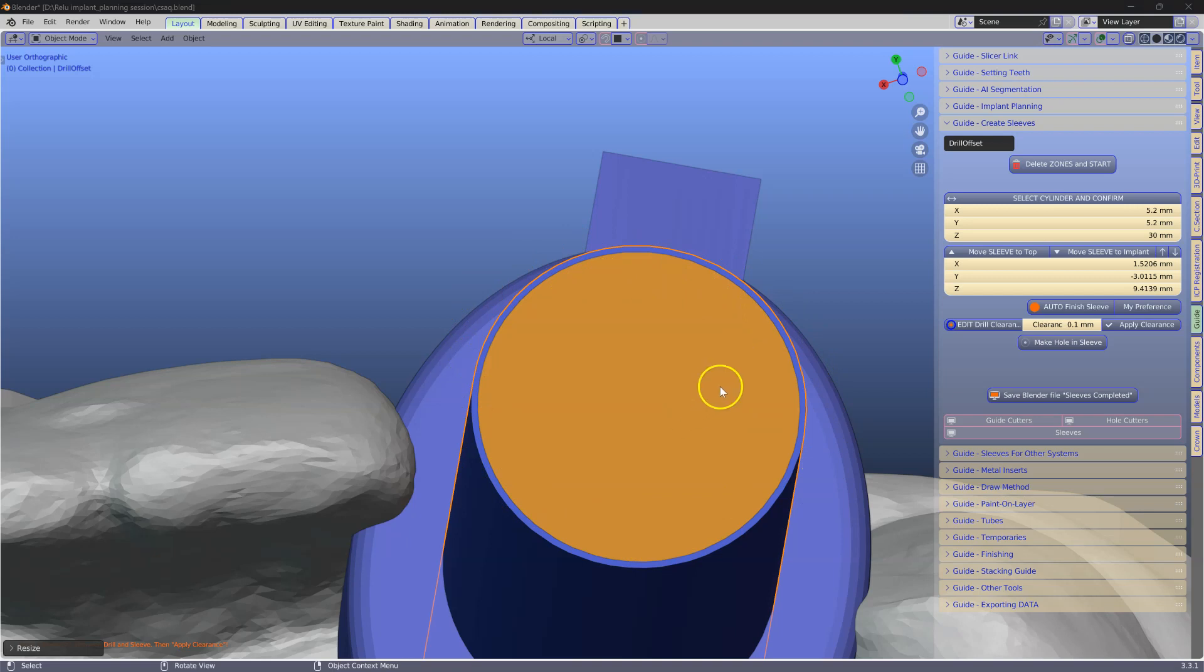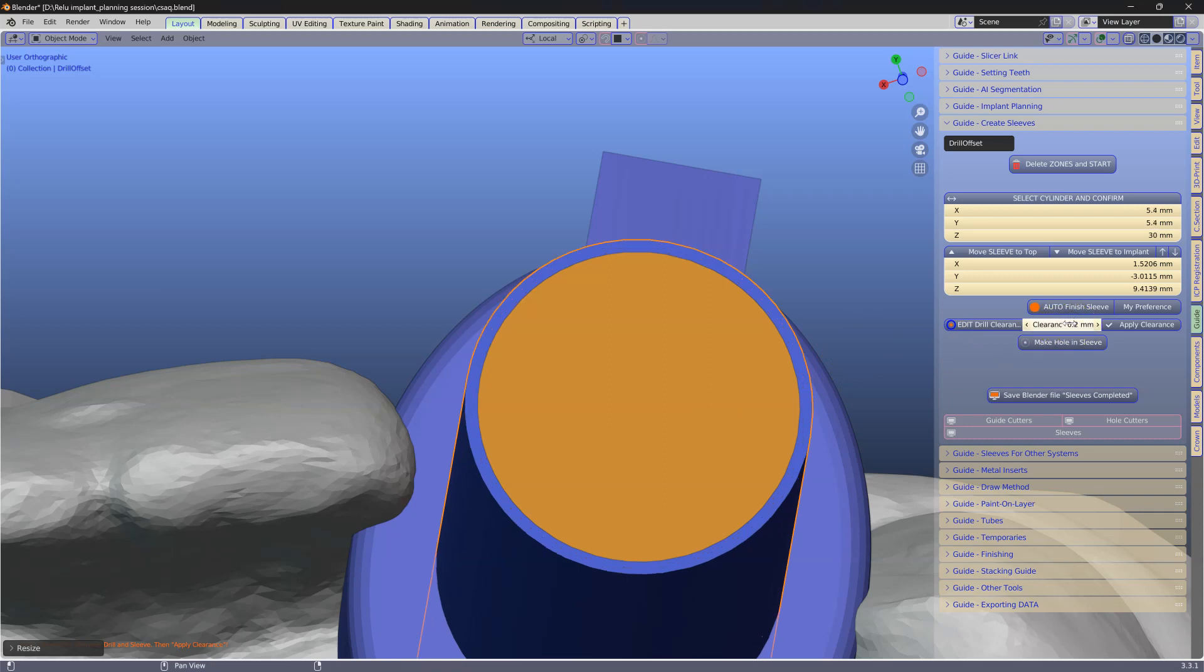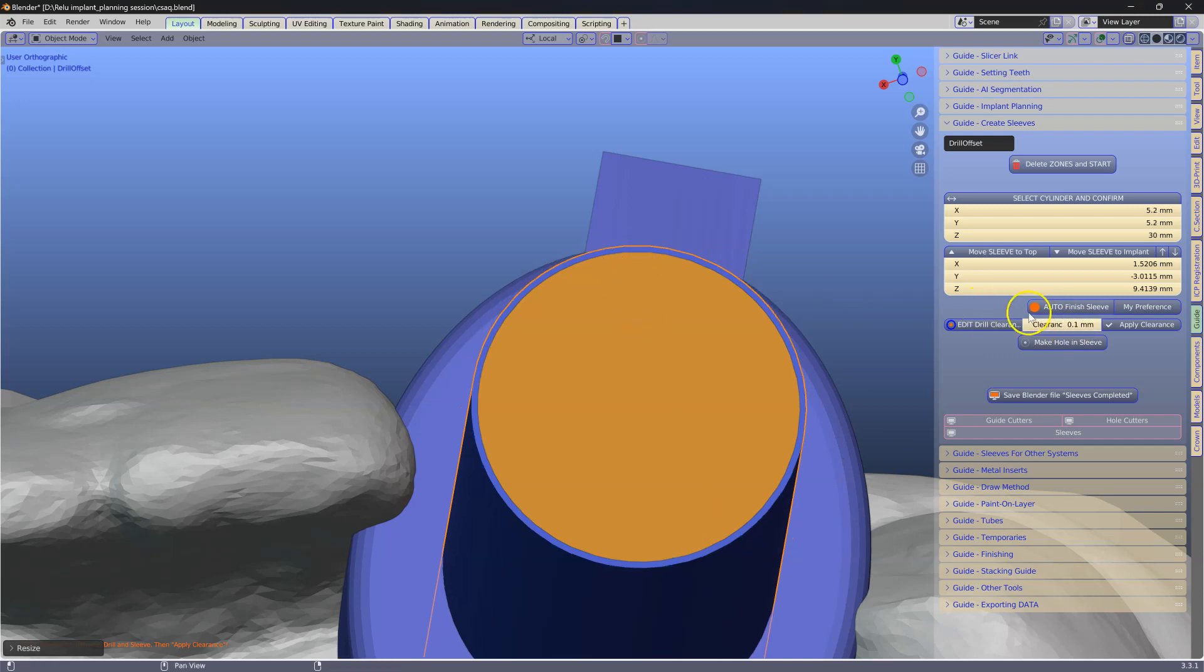If you find your drills to be too tight, this is where you are going to change it. So if I put 0.2 it will add 0.2 on either side. For this example we are going to keep it to 0.1.